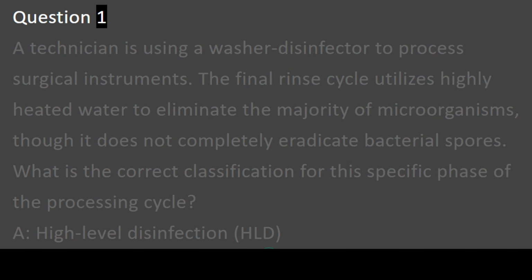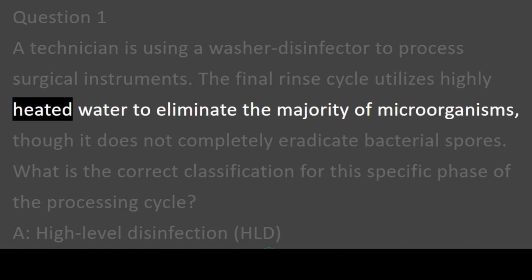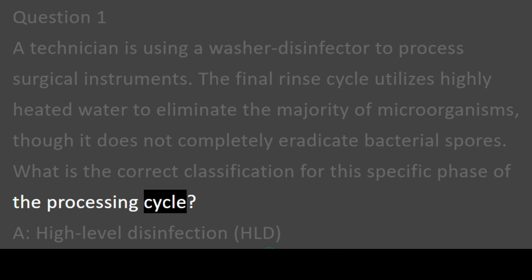Question 1. A technician is using a washer disinfector to process surgical instruments. The final rinse cycle utilizes highly heated water to eliminate the majority of microorganisms, though it does not completely eradicate bacterial spores. What is the correct classification for this specific phase of the processing cycle?